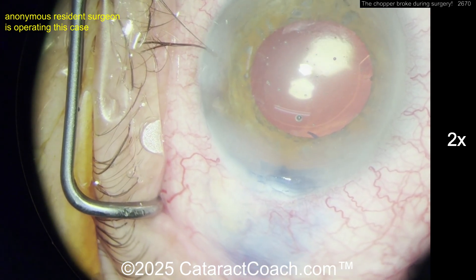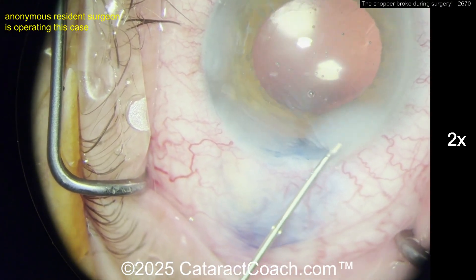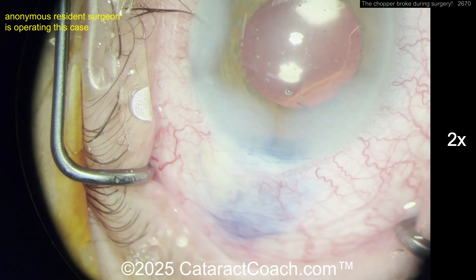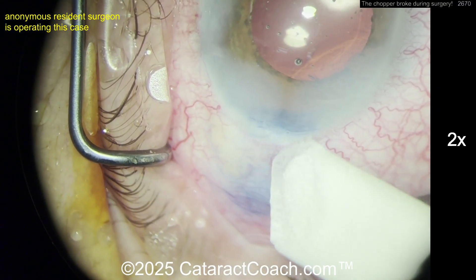Consider switching over, like I've done, to all titanium instruments. The blue color of titanium is just from anodizing — when you run electricity through it you can change the coloring of the titanium. I like blue because that's my favorite color.